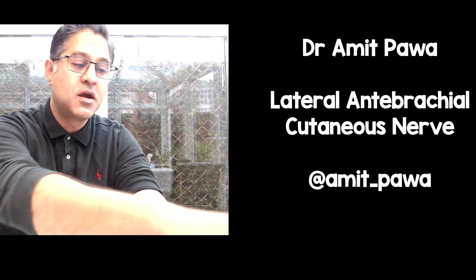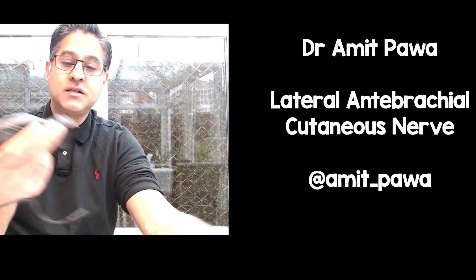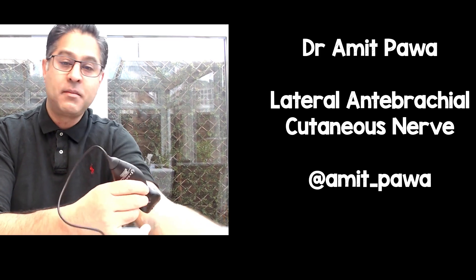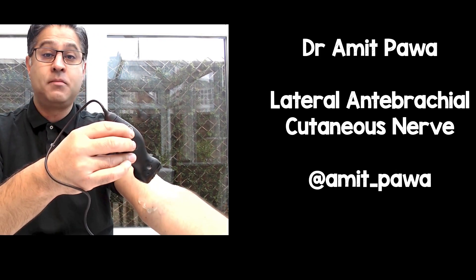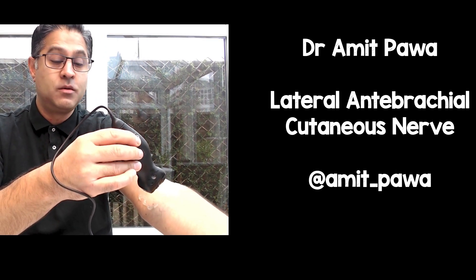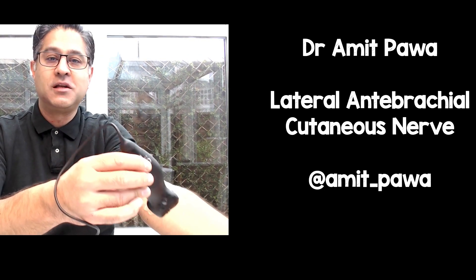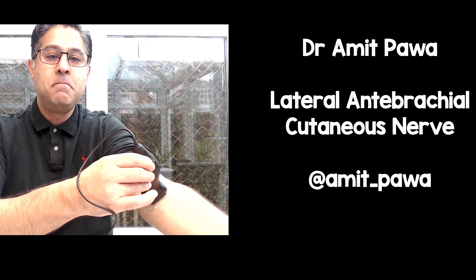What I do is I take a high frequency linear probe. I happen to have a handheld device at home. I'm going to hold it high up so you can see what I'm doing with the probe, but this is not how I would hold it in clinical practice.